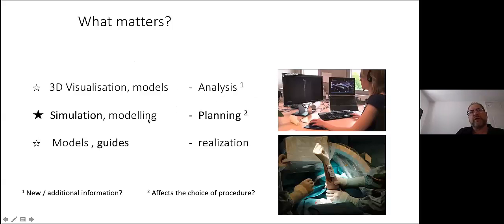Yeah. And then you have the simulation and the modeling where you plan together with the engineer and the surgeon. Well, maybe Kathleen can plan herself, but I only do the surgical part, so I'm not good with this software program.